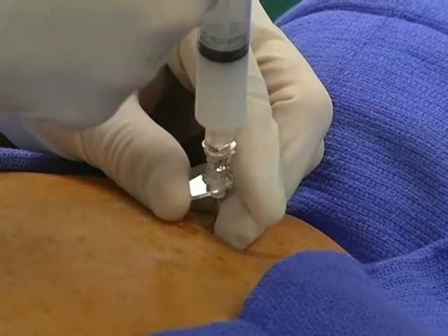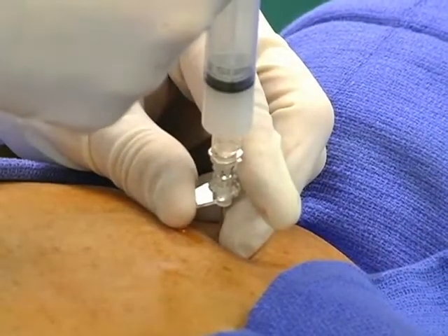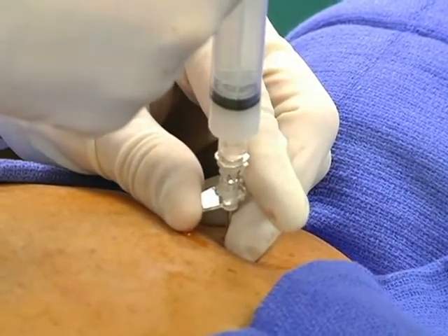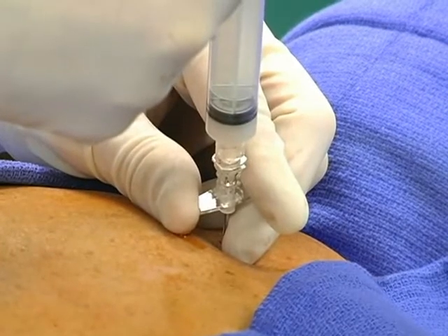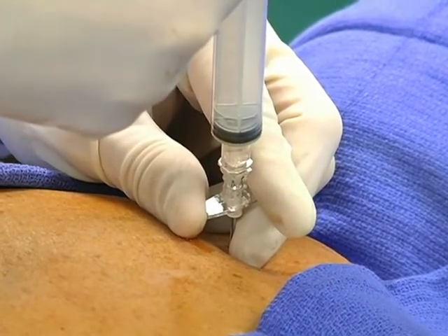Slowly inject 2 milliliters of 1% preservative-free lidocaine without epinephrine and 2 milliliters of 6 milligram per milliliter Celestone Soluspan slowly into the epidural space.